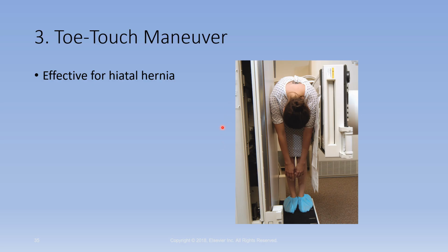The tube is down here and radiation is coming up this way, which means that a lot of radiation has the potential to leak out here. So that's the need for that bucky slot shield. The footboard is attached to the table, and typically we step on that to make sure that it's not going to go anywhere, make sure the patient's not going to go anywhere when we put them on there.